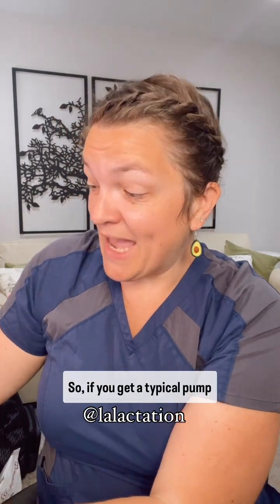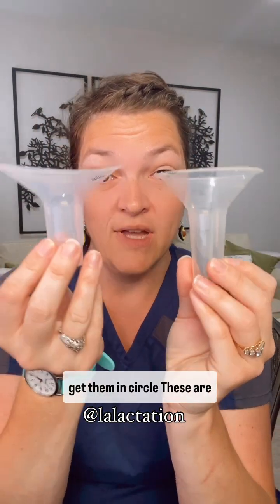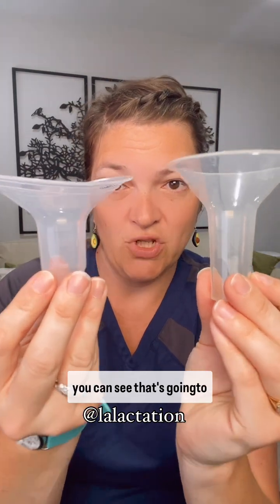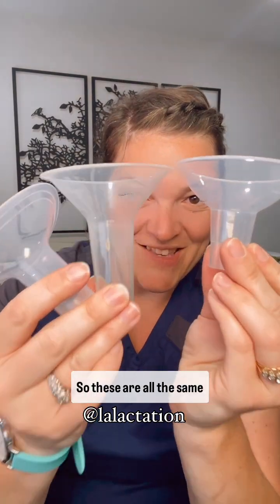If you get a typical pump in the United States, your pump will come with a tapered regular flange. This is Hygieia's, this is Medela's. Medela has a tapered flange that's oval or you can get them in circle. These are actually the same sizes, but you can see that's going to approach the breast totally differently. They also make crater flanges, and you can see that's going to approach the breast very differently as well.